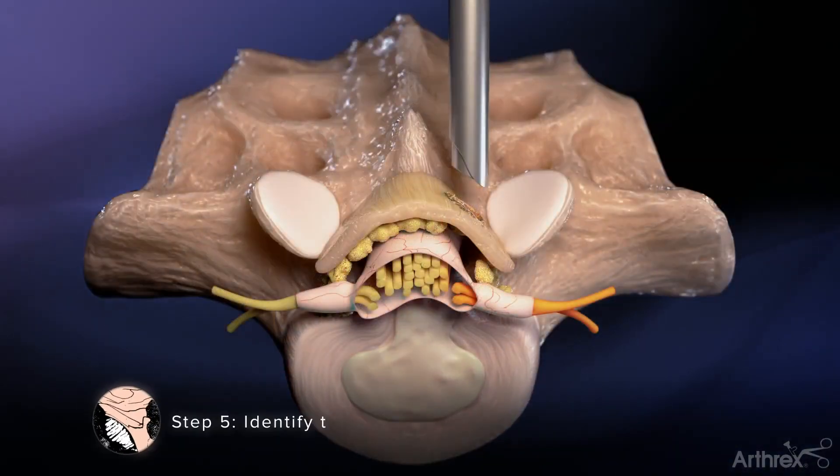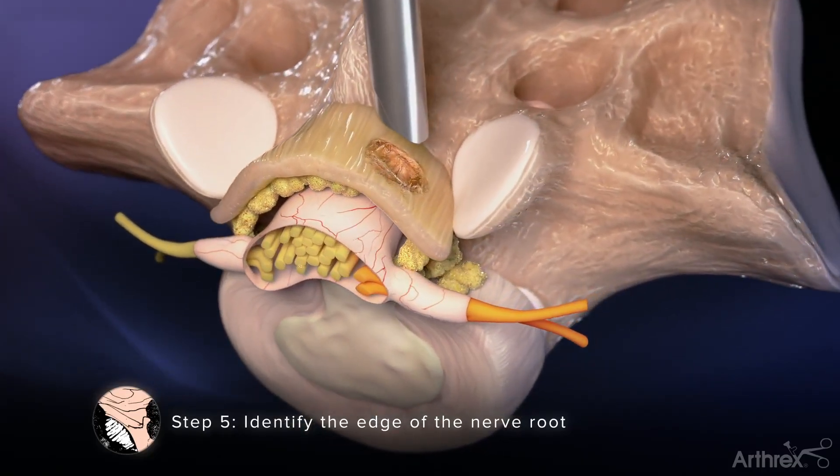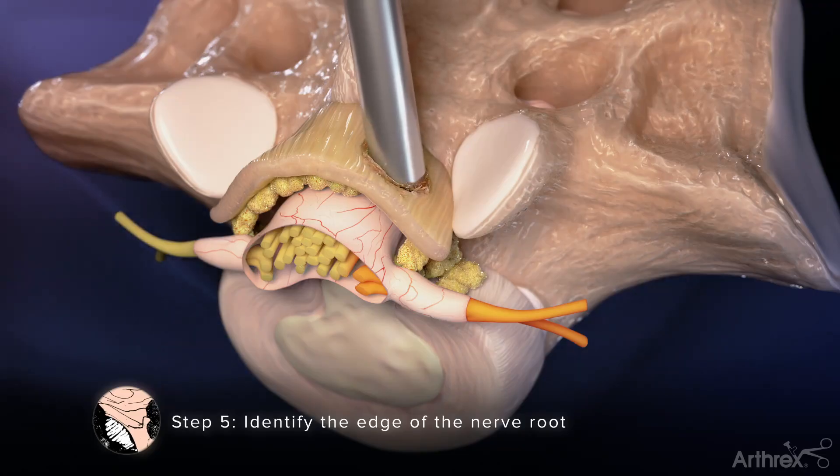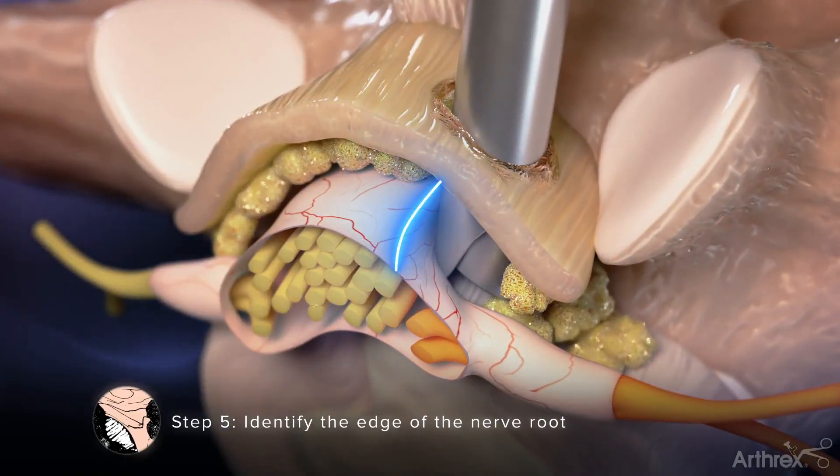Step 5: Identify the edge of the nerve root. Once a sufficient amount of ligament has been excised, slowly advance the cannula through the ligament and into the spinal canal with the bevel of the cannula facing medial, allowing the edge of the nerve root to be clearly visualized.